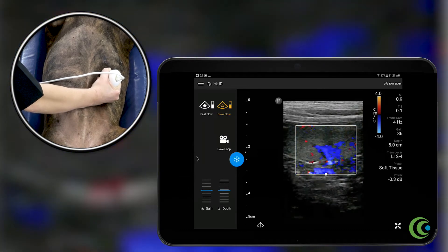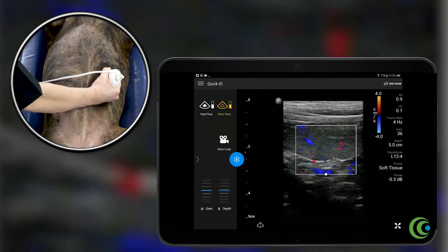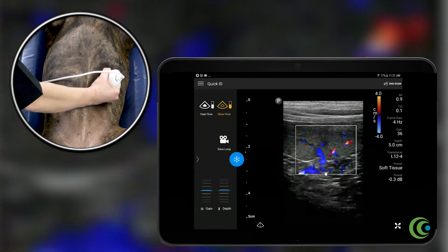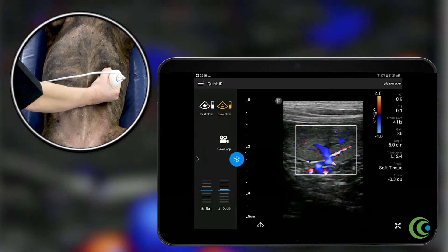As we have the spleen in focus, you can apply the color Doppler, and you can see that the splenic vein at the hilus has a great away signal that's identified by the blue. There is no obvious clots within the splenic vein going into the spleen. You have great normal parenchymal flow.